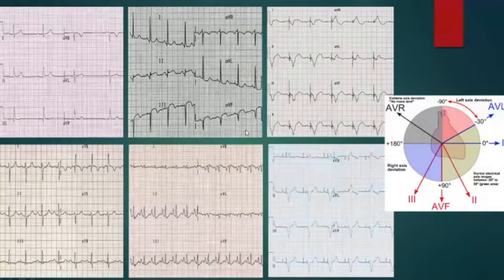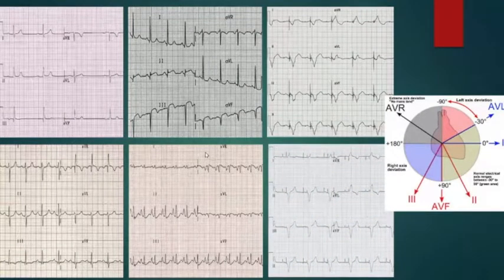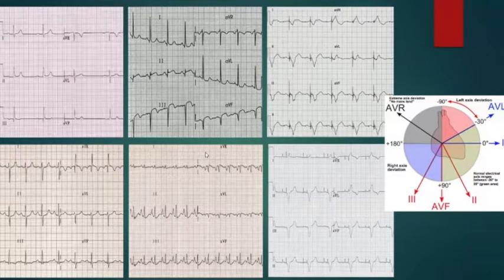What are the normal ranges of P waves? What are we looking at? Less than 120 microseconds? Milliseconds, sorry. So we check its length and we check its height. Length is defined by time, height is defined by voltage. So you are completely right.